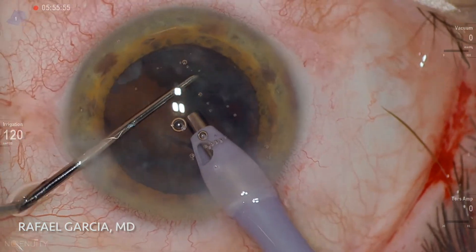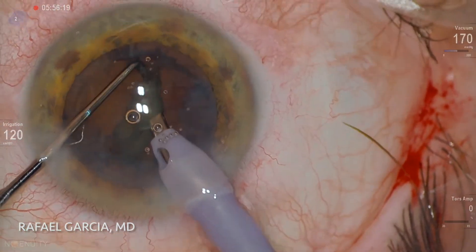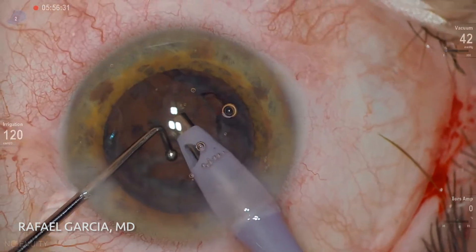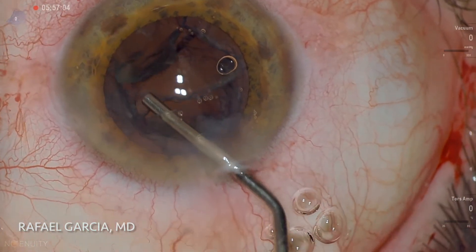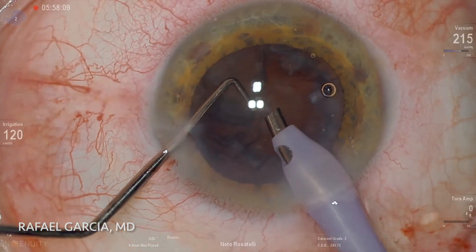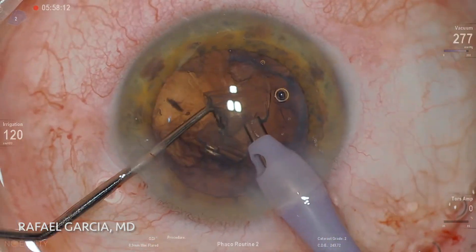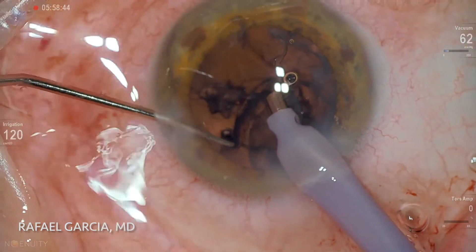We are left with a thick and gummy epinucleus shell that is mobilized with the chopper. Using vacuum modulation, we go around carefully aspirating the peripheral epinucleus. One must be really cautious here in order not to inadvertently grab and damage the posterior capsule. Some viscoelastic can also be employed to mobilize the fragments and protect the capsule.